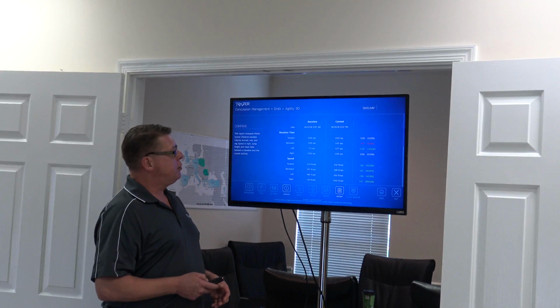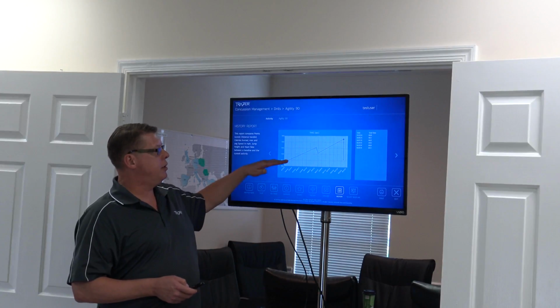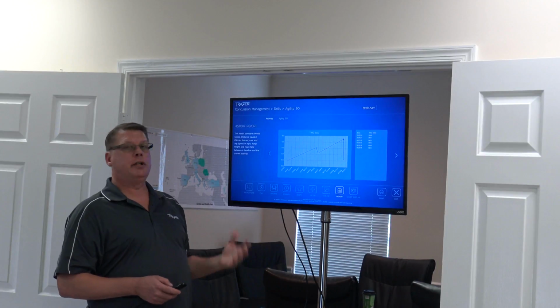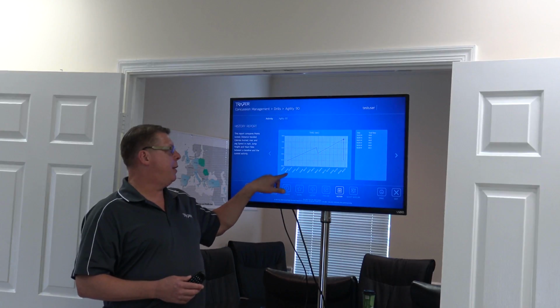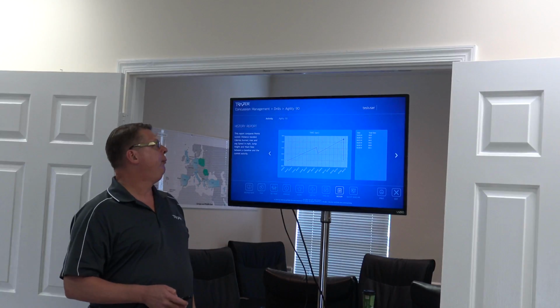Now, tracking the individual over time, you simply go into the history. So what it does is it provides a longitudinal graph on either improvement or degradation of an individual. So whether it's treatment, athletic performance, or something else, you can track somebody over time. As I mentioned, each point in time where an activity is completed is date time stamped.